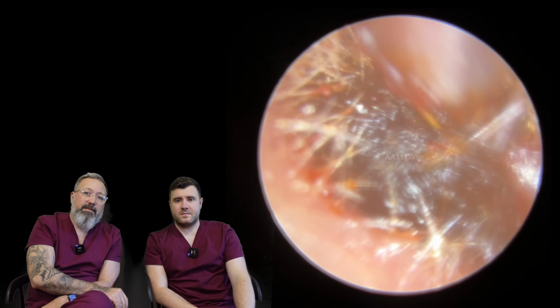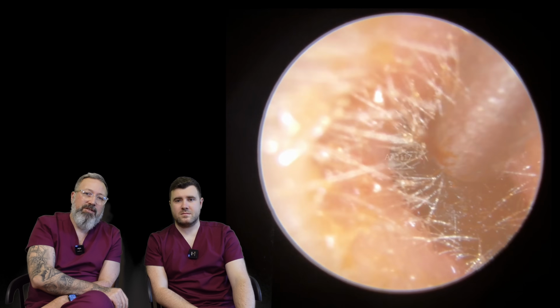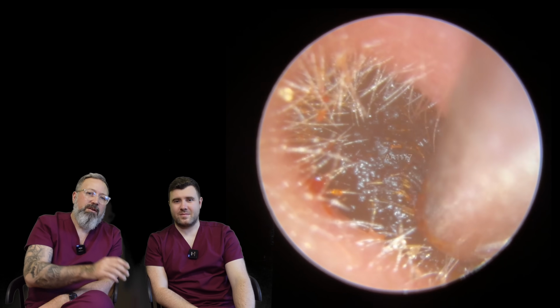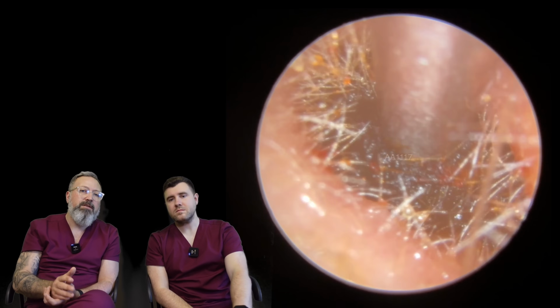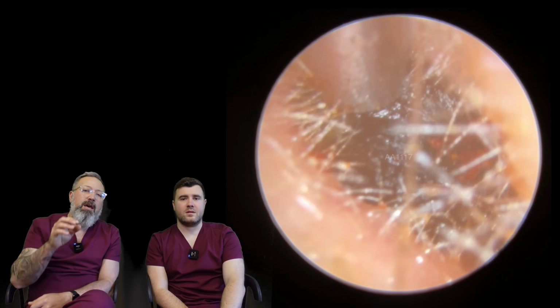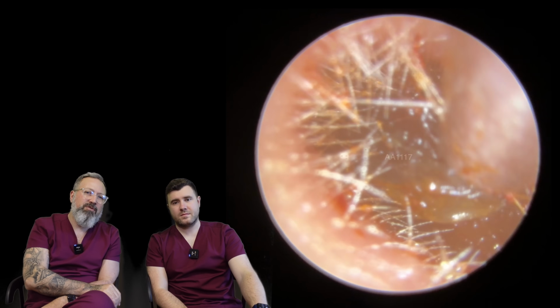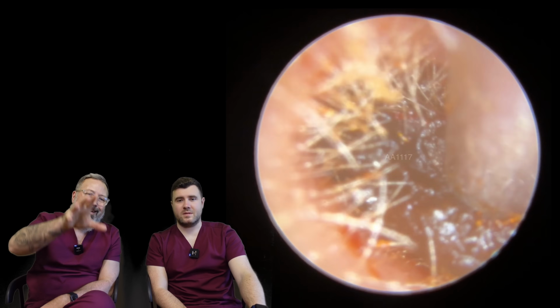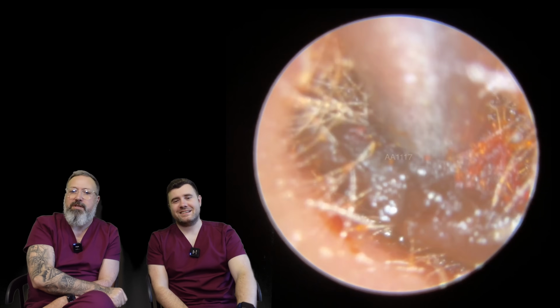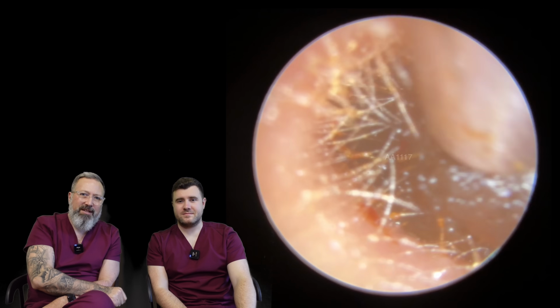It's nearly there. Let's give this a little bit more persuasion to come out. It just gets a little bit stuck. Now at this point, if it was a wider canal, I'd go in with something like a Rye curette or Jobson Horne. But when it's narrow like this, it's always difficult to get a curettage tool in there, because a lot of the time you'll end up pushing this plug back in rather than getting behind the plug. Or squishing it everywhere, which makes it even harder to get out. Oh, it's a nightmare.